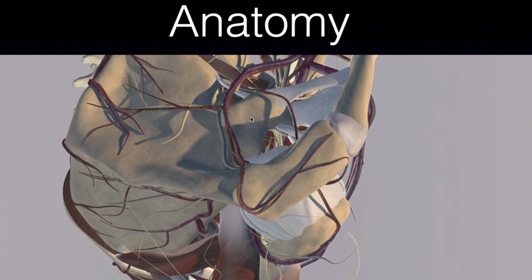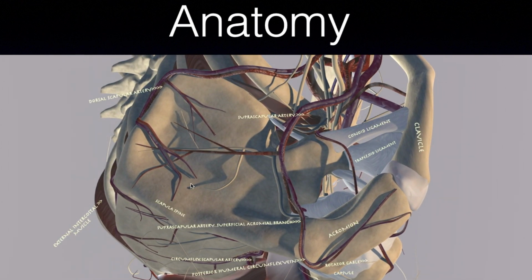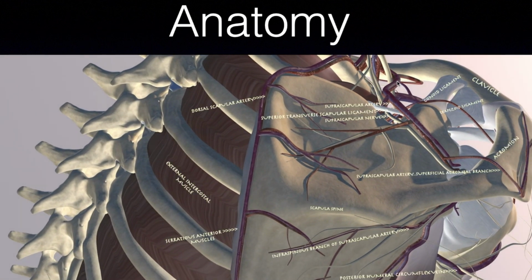And then if you look again at the bird's eye view of the shoulder, you can appreciate these bony concavities where your supraspinatus tendon lives, and your infraspinatus tendon lives as well. You have your transverse scapular ligament, where the suprascapular nerve goes underneath that structure, and the suprascapular artery goes above it. It's actually pretty hard to find, I think, but if you can put on your Doppler and find the suprascapular artery, then you know the nerve lives right underneath that.